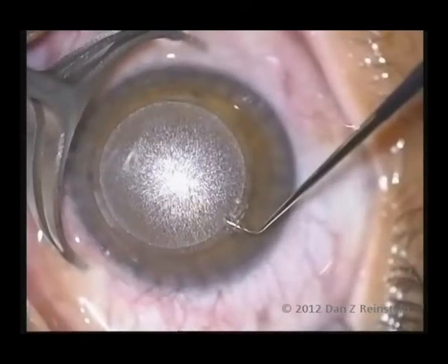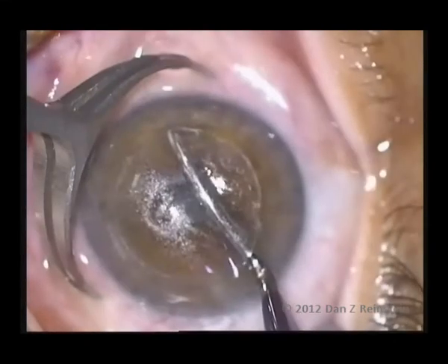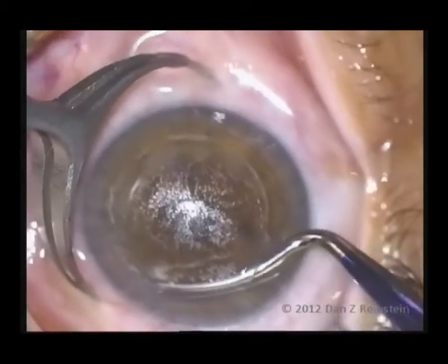The manual portion of the procedure consists of delineating the upper and lower aspects of the lenticule border, separation of the superior and inferior lenticular interfaces, and extraction of the lenticule through the 2 mm keyhole incision.